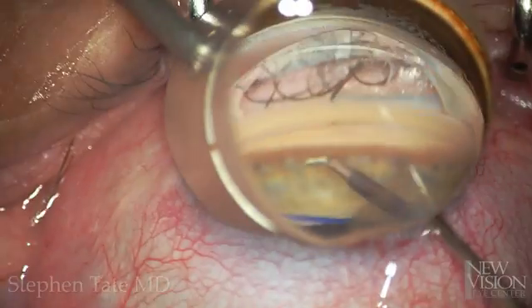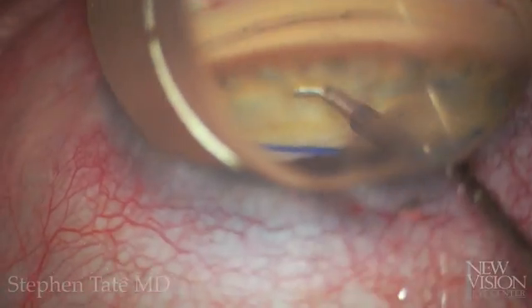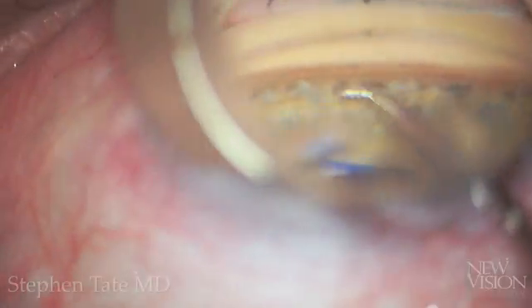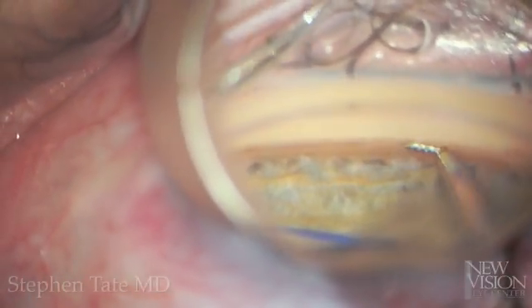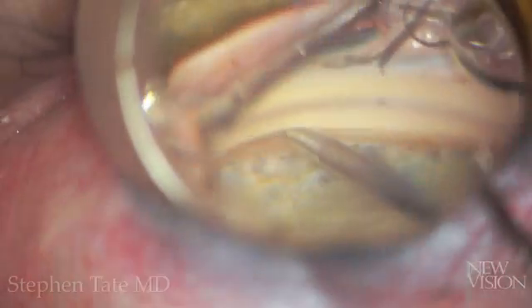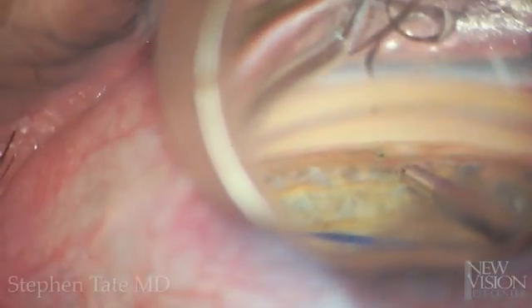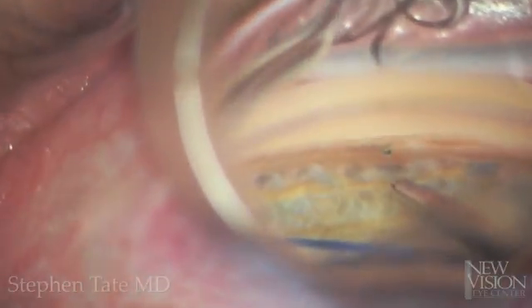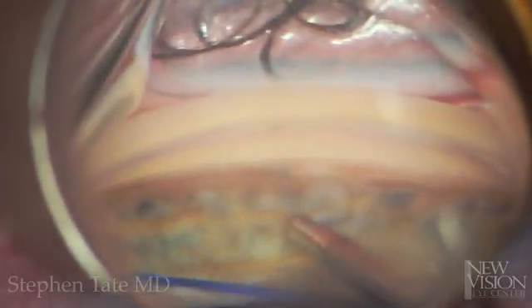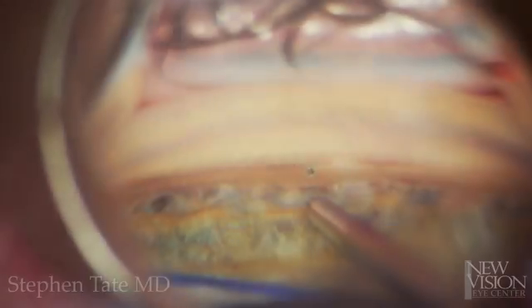Number two is filling the anterior chamber. The angle is filled with a cohesive OVD until IOP approximates 15 to 20 millimeters of mercury. With 2.4 millimeter incisions, this can be achieved by simply injecting the OVD until it refluxes from the CCI. One useful tip is to inject the cohesive OVD in a way that displaces any dispersive OVD from the angle of the eye. This makes viscoelastic removal from the angle easier at the end of the case and may help avoid post-op IOP spikes.